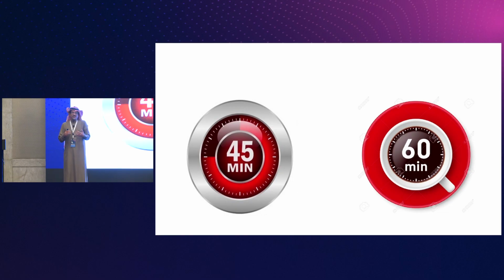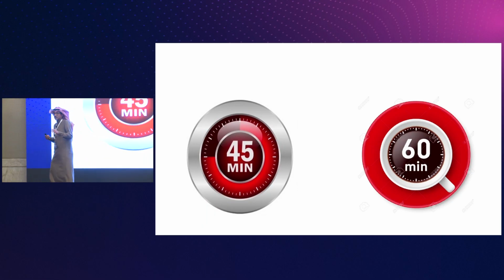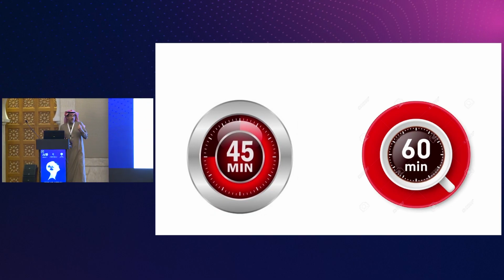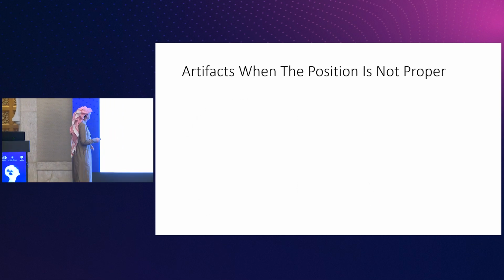She will ask many, sorry to say, foolish questions because she is worried. She is waiting for the result before the exam. So just give her time, and give her like 45 minutes as a slot for the exam. Okay.